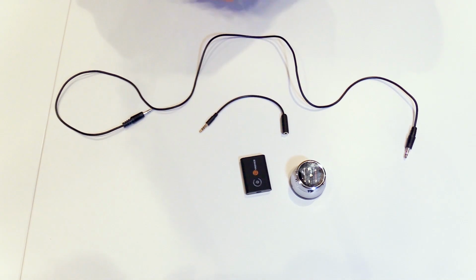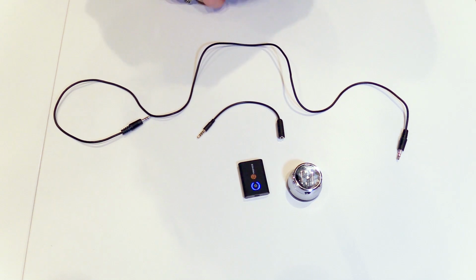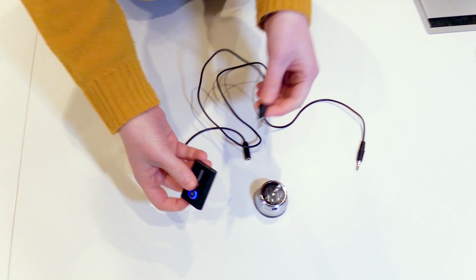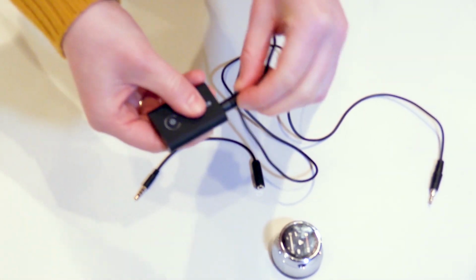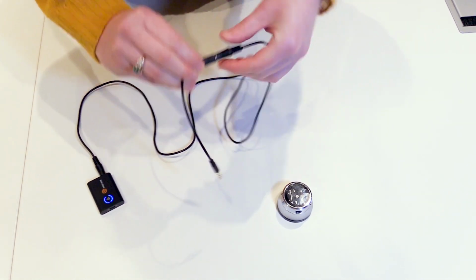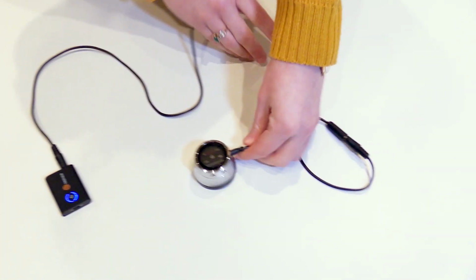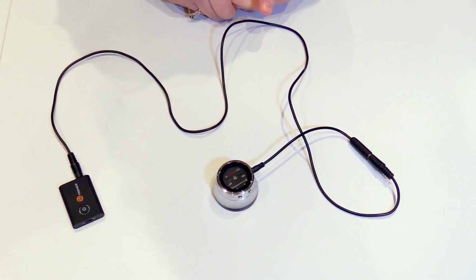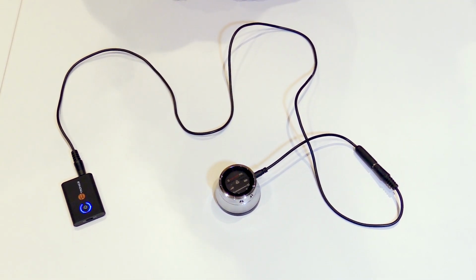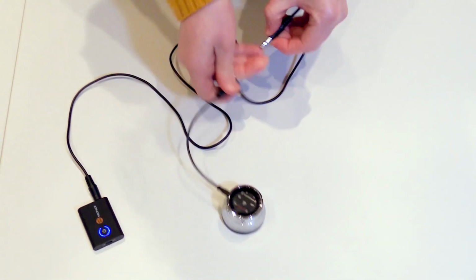First, before you begin, you want to make sure that the Phonak Marvel hearing aids are paired to the transmitter. After it is paired to the transmitter, you can go ahead and, using an audio accessory cable, plug it into the transmitter, and then using the adapter cable so that it can plug into the stethoscope. And now the client should be able to perform auscultation and have the signal stream to the hearing aids via Bluetooth. If the client wishes to use a Roger microphone, we can just unplug this cable.